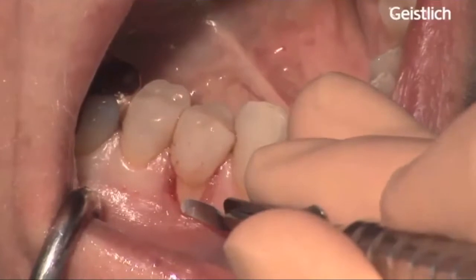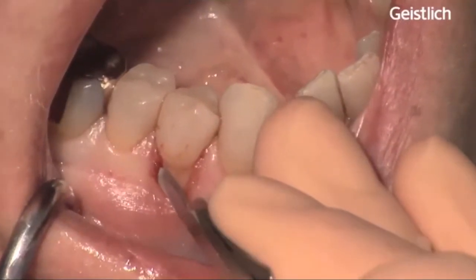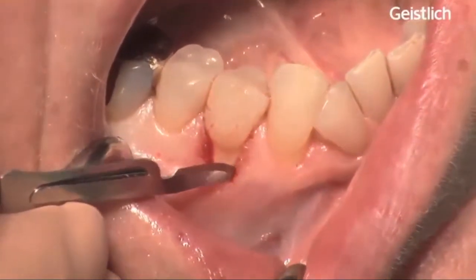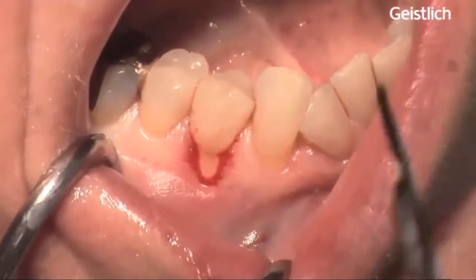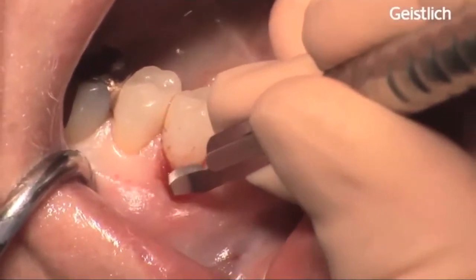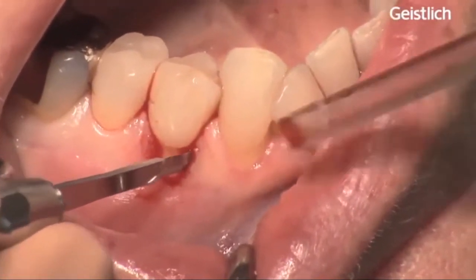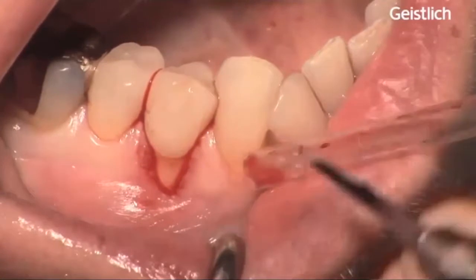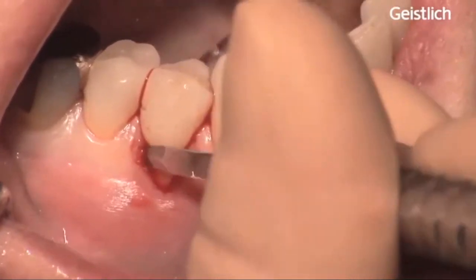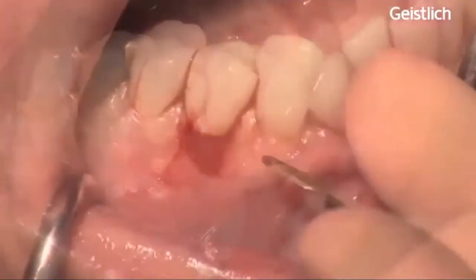The flap elevation procedure starts with an intrasulcular incision using microsurgical instruments. The intrasulcular incision is followed by a horizontal incision interproximally at the level of the cemento-enamel junction.